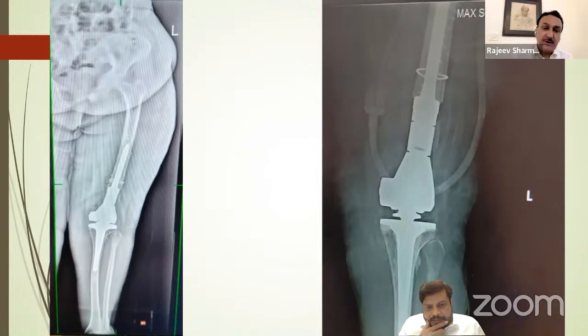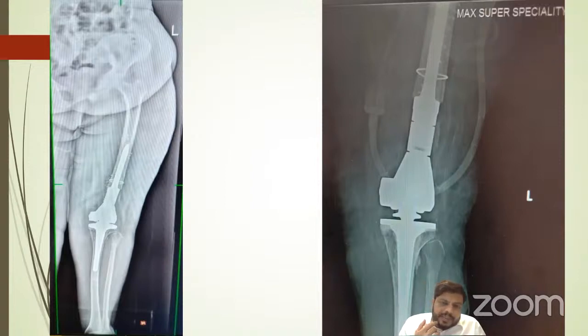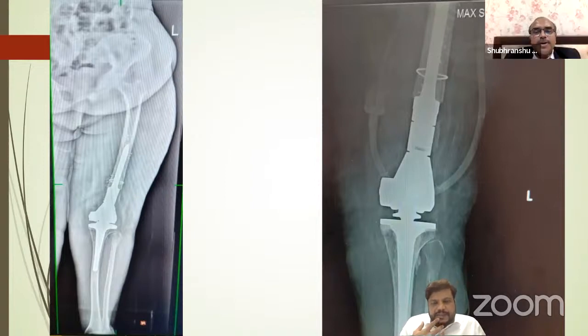This is LPS. But did you need to do the osteotomy to such a large extent, or could you have reduced it for some reason? No, sir. I didn't extend the osteotomy. The fracture was extending up to that part, and I just removed the fractured bone. In fact, the bone here was very thin. That's why this circular wire is also there. While hammering, it was getting shattered, having a splinter. So I just put some circular wires. A prophylactic wiring can also be done before.